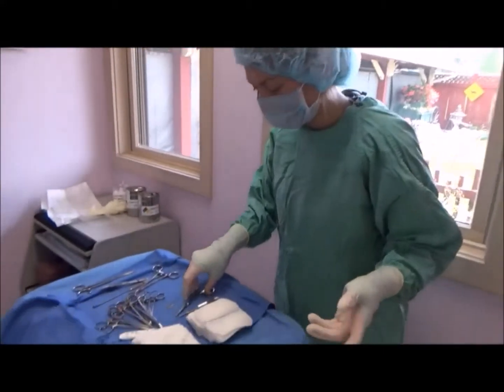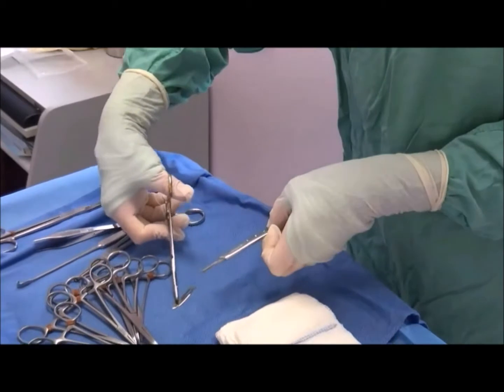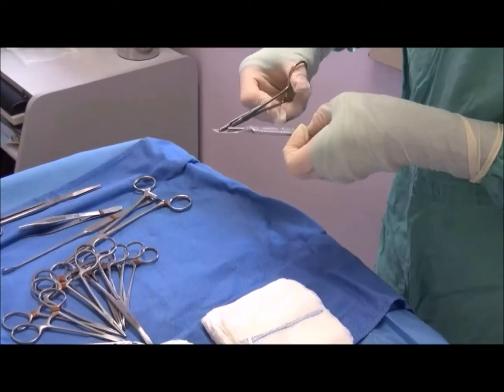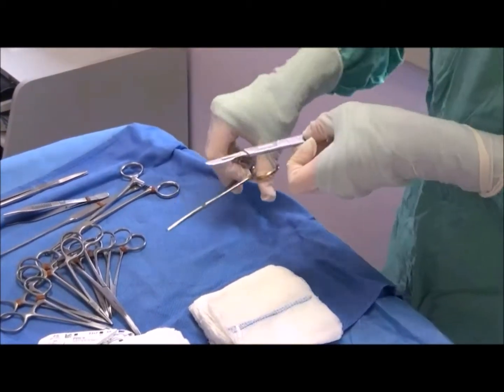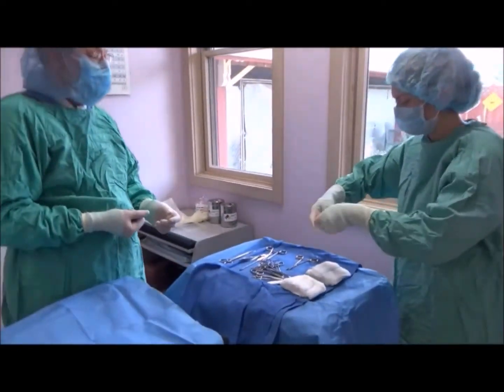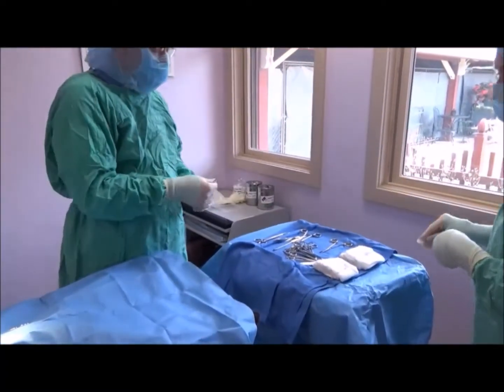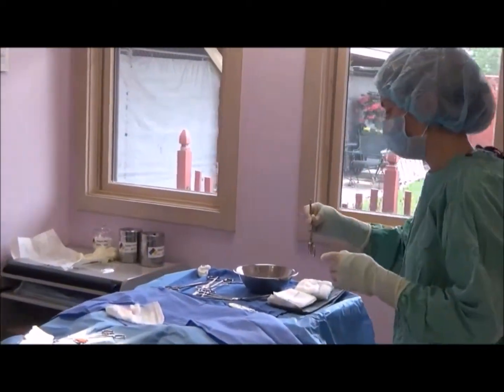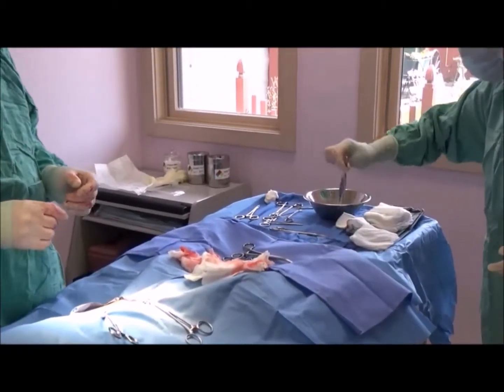Okay, now I'm going to load the scalpel blade onto the scalpel handle. That's good. Once the doctor's ready, I'll hand it to him. Doctor needs thumb forceps.